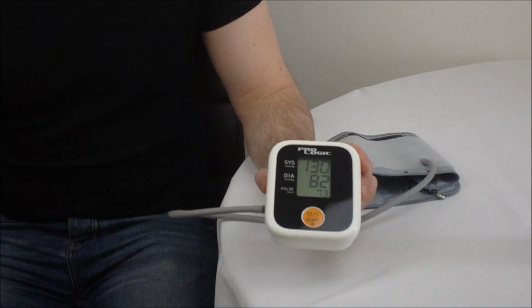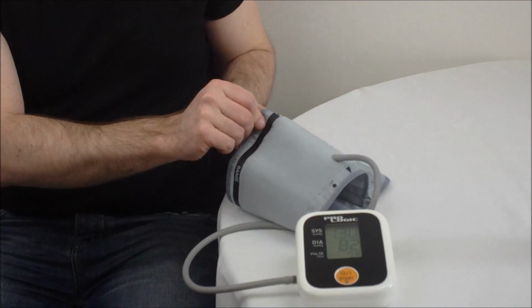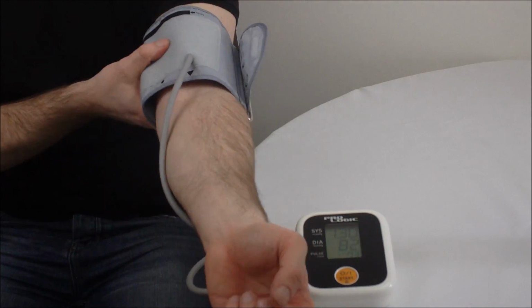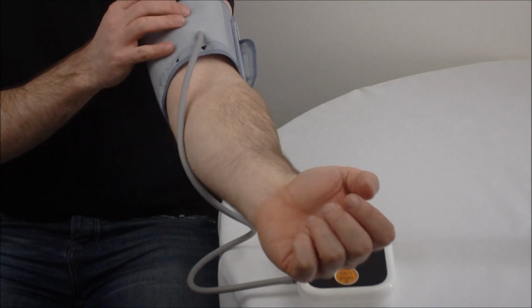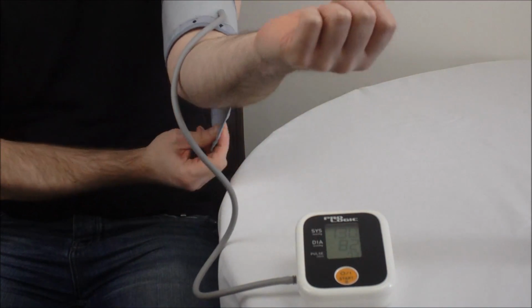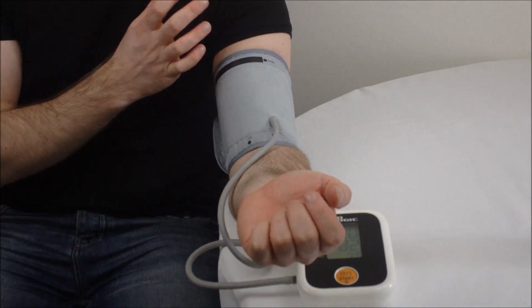In this video we're going to look at how to take your blood pressure measurement. Now, once you've set up your blood pressure monitor, you need to just slip the cuff up your arm. This slides up quite easily, and you want to be able to bend your arm so the cuff is going above the crease in your arm, and you should allow a small gap of about 2 centimeters above the crease in your arm.